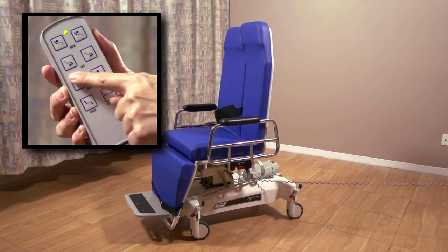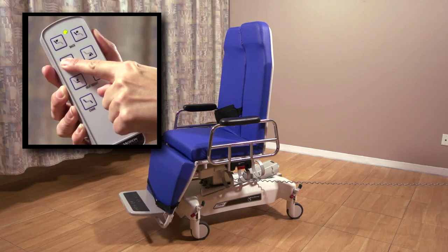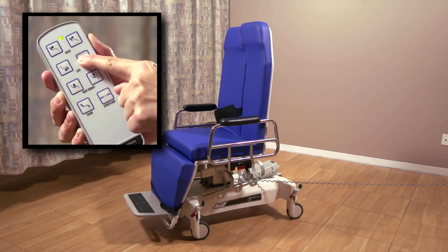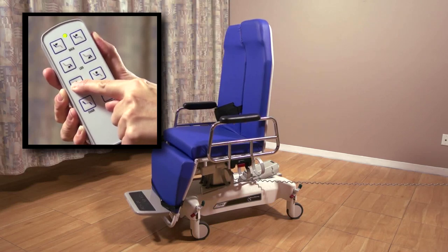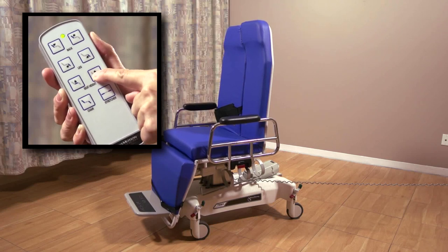The top row of buttons controls the leg adjustment. The left button raises the leg section, and the right button lowers it. The next row of buttons controls the height. The left button raises the seat, and the right lowers it.